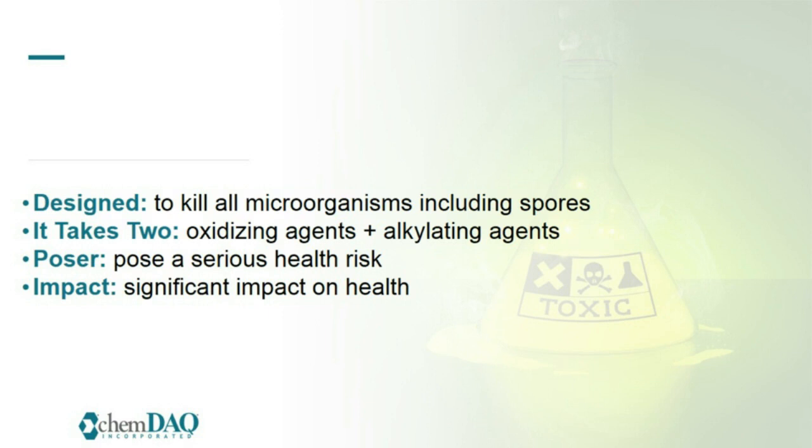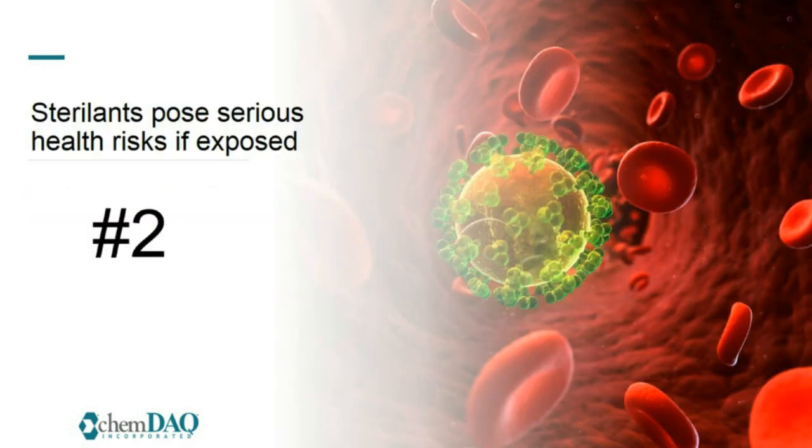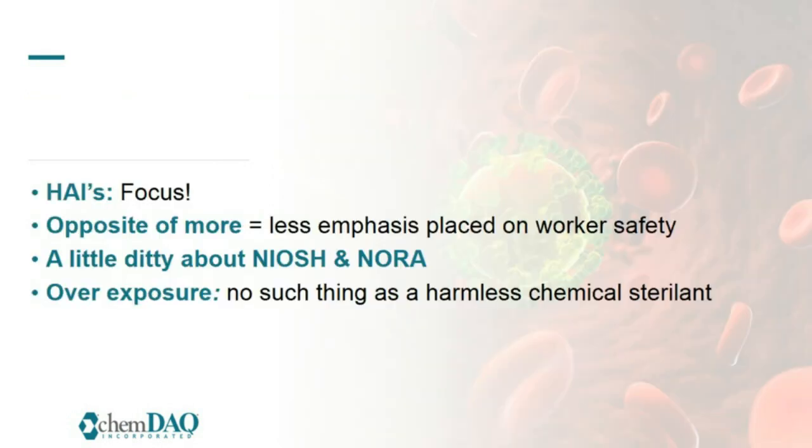Number two, sterilants pose serious health risks if you are exposed to them. Hospital-acquired infections, there's a huge focus. As you know or may not know, in this country, every year we have approximately 2 million hospital-acquired infections. Of these, we have approximately 100,000 deaths.